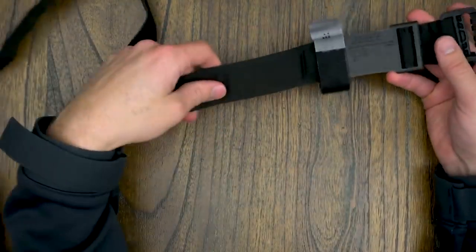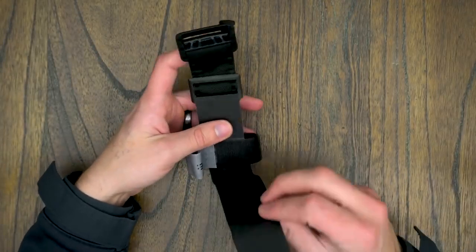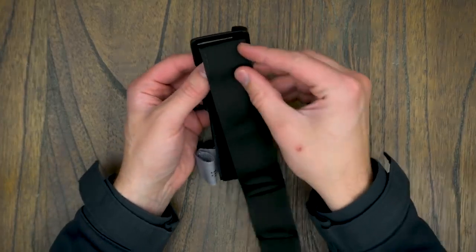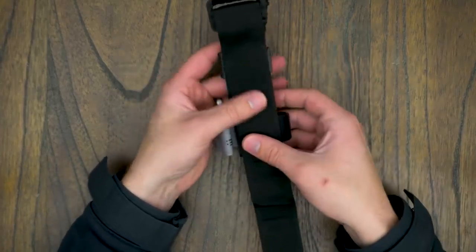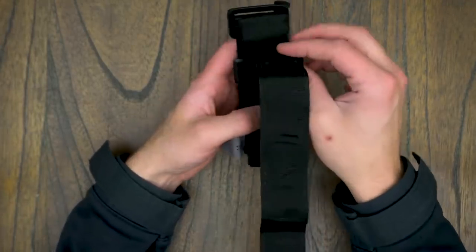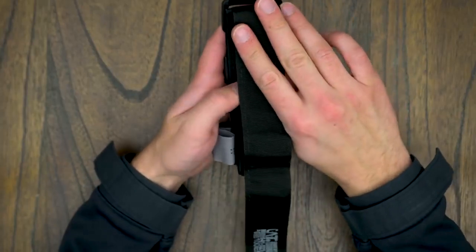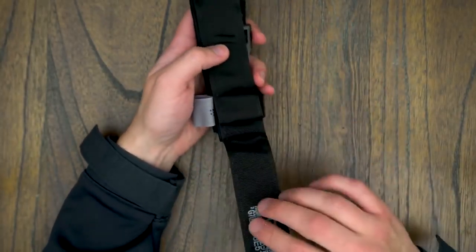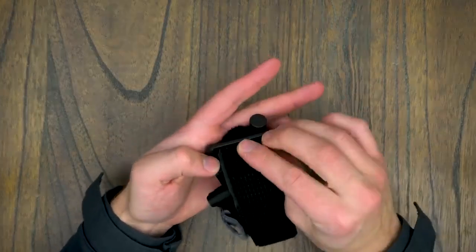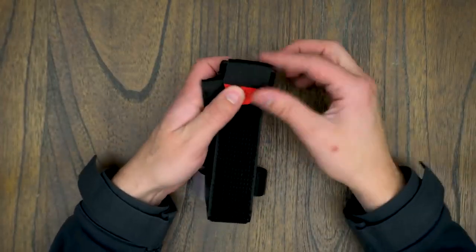So to fold it in this method, you pull everything out, and then you're going to take this first loop and bring it up to that buckle and fold it back down on itself. Then you do the same thing and you take the back end and fold it to the top of that buckle and fold it down. And then you take the last section and bring it up, and you're going to take it through this buckle only slightly and fold it back over.